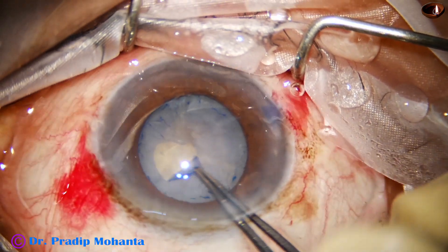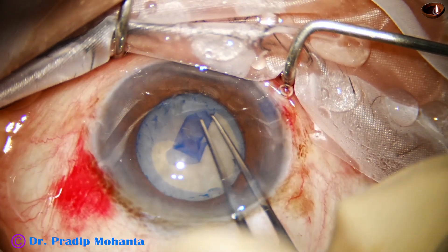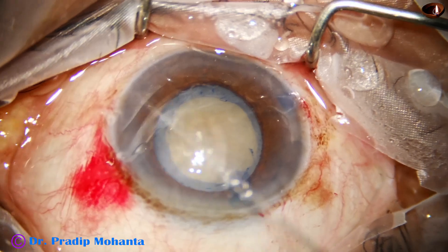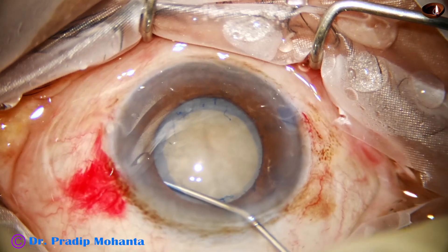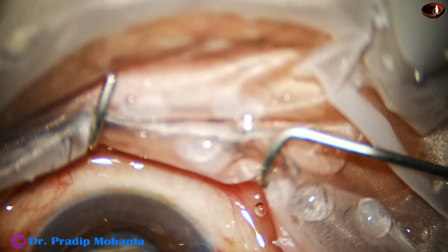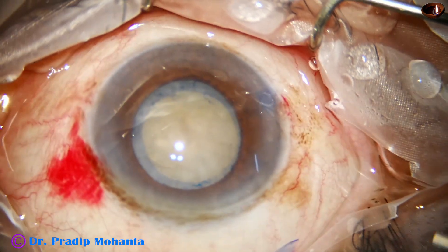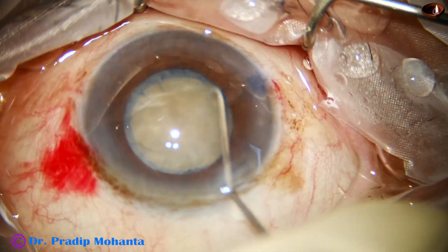Now I start doing the rhexis. Even if we don't detach the anterior insertion of zonule, we can start the rhexis — it just gets torn off — but it is better that we detach its attachment on the anterior capsule. Otherwise, if we just tear it off, the traction is on the ciliary body also. So the better approach is to detach its anterior insertion.